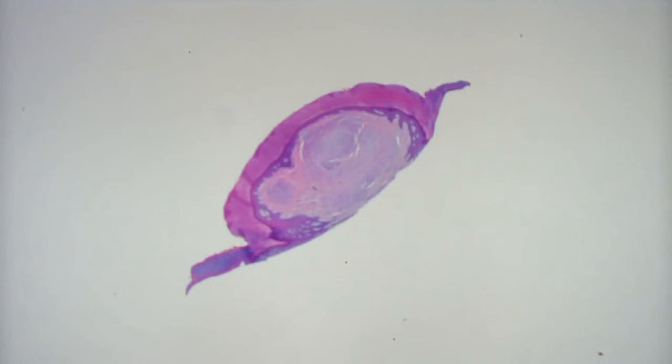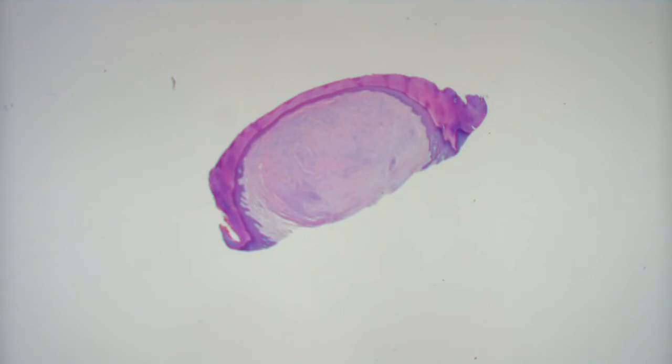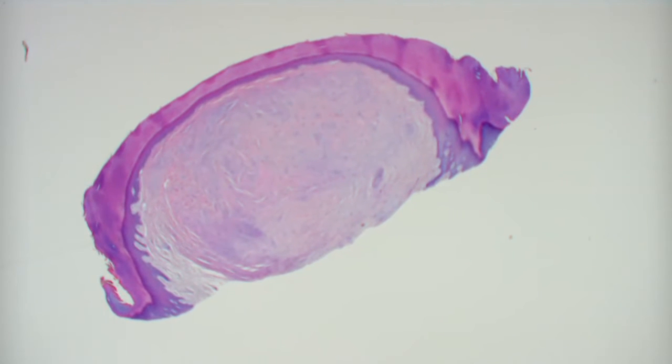This is more Jay's category, or Gina's. This is more you guys. I'll attempt it, then I'll pass. So I got a shave biopsy on what I thought was acral skin here. A very well circumscribed, dermal-based papule. The epidermis looked a little atrophic, so it was being pushed up on by this ball of dermis. I call this a sclerosing perineurioma.